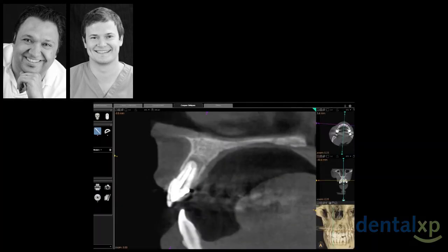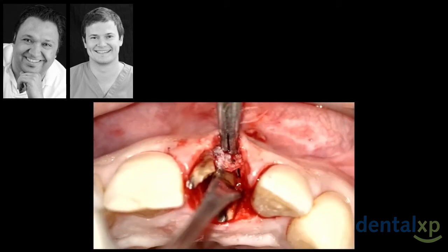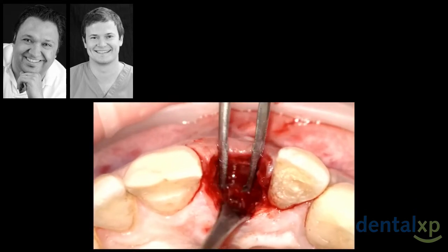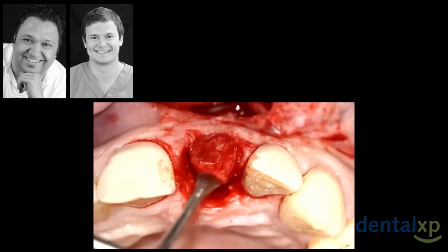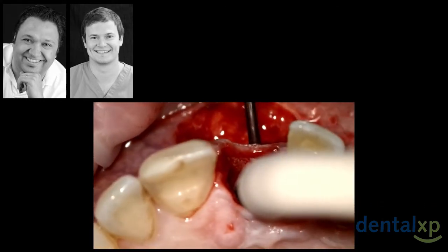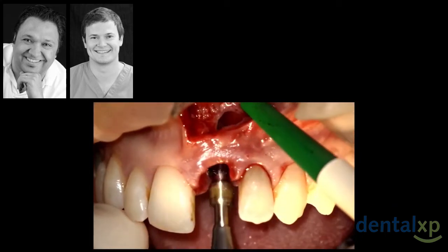And to talk about precision, we have selected this clinical case, which is interesting in my opinion because this is a really challenging case. This is a conventional one. This is a freehand surgery. You see, in this case, despite a major apical lesion, we decided to go to immediate implant placement just because of the persistence of a very thin buccal plate.